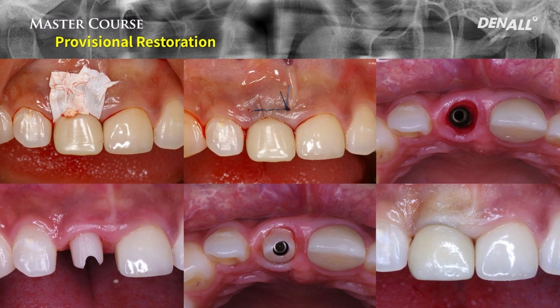The standard provisional restoration can also be done in this patient. The patient had very unfavorable conditions for provisional. The clinical crown length was short and she had a deep bite. It was a female patient, but I had to provide the provisional. As you know, when the provisional is connected to the implant directly like this, it should not be in the anterior guidance as well as the lateral guidance. So it is very tricky.